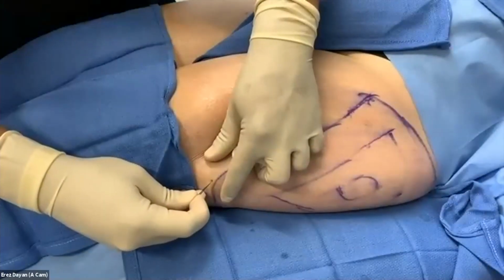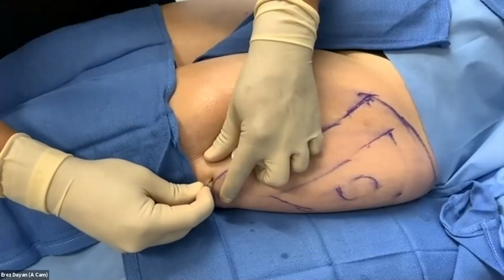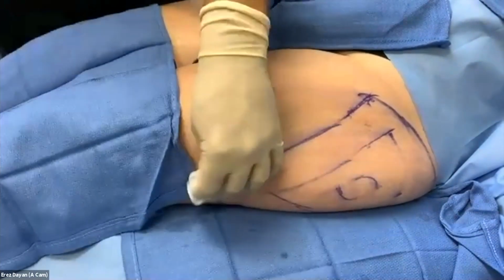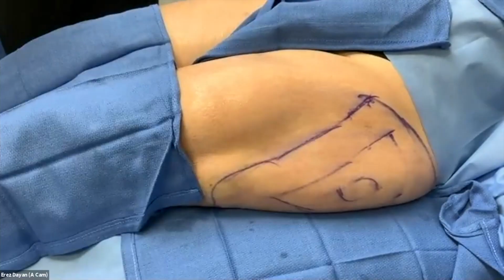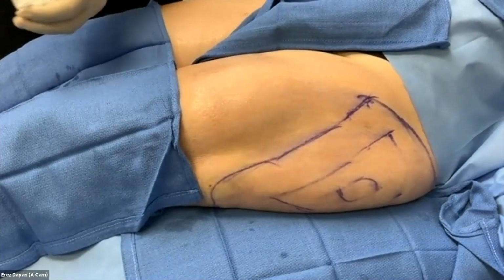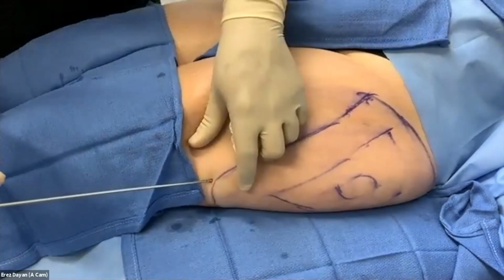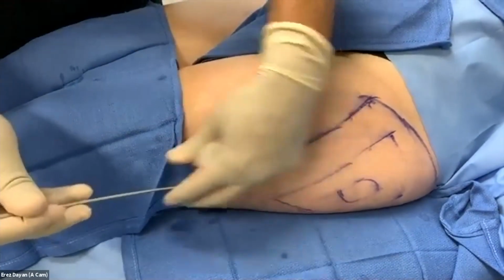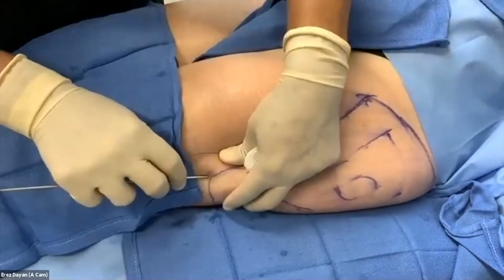I'm going to take a little 11 blade, just make a little access point here, nothing too large. And then I'm going to come in with my tumescent infiltrator. Just let me test it here. Okay. So you just kind of get in the area here. You okay there, Sam?